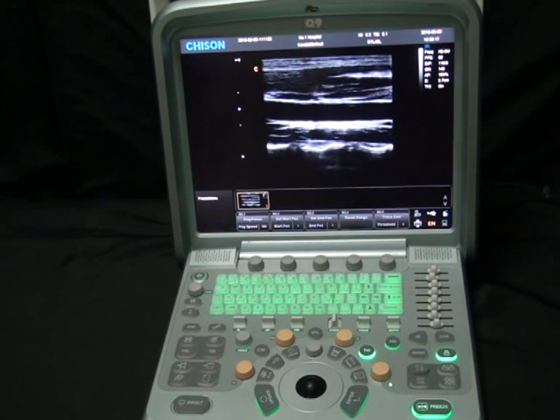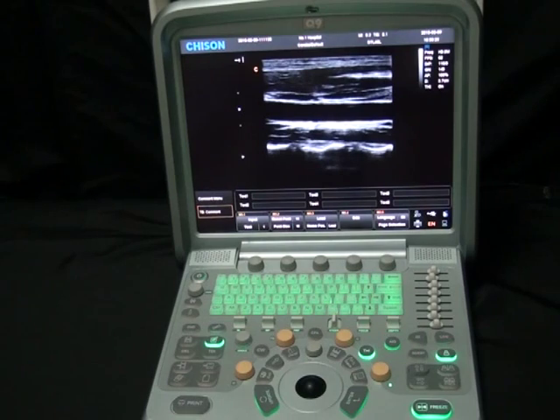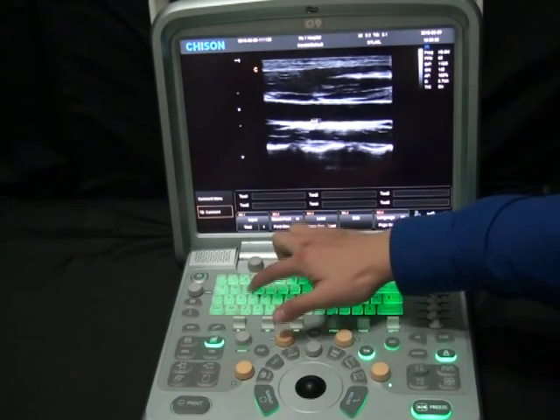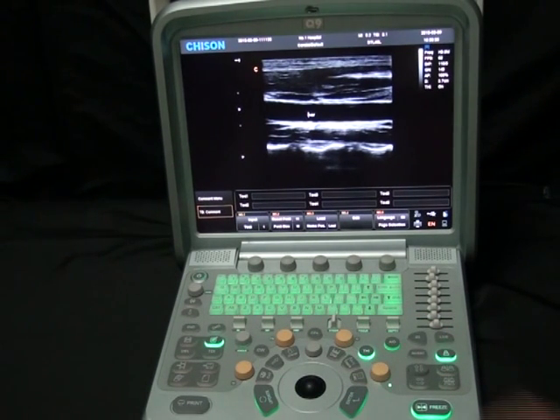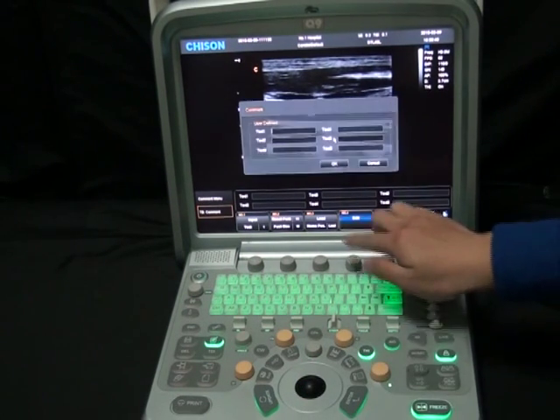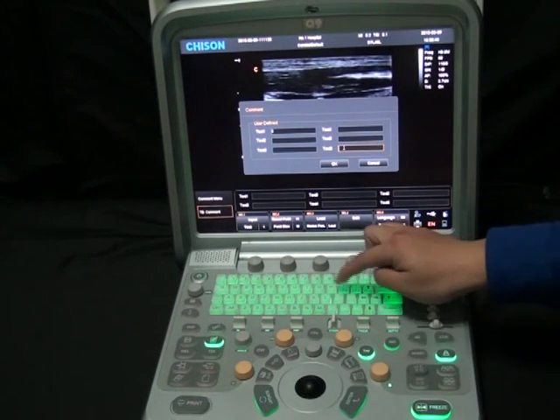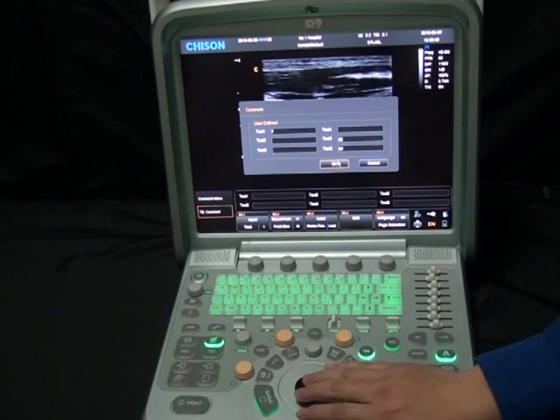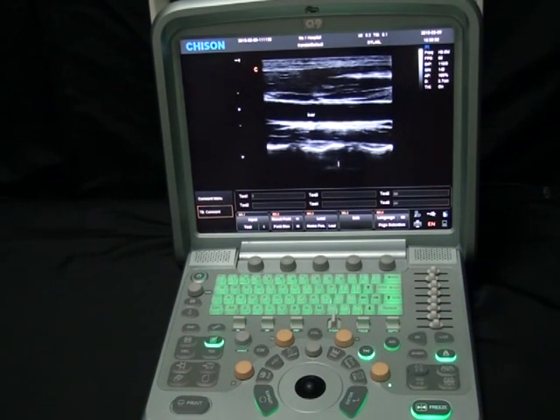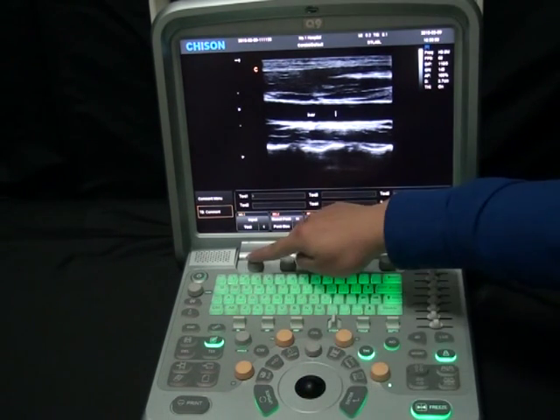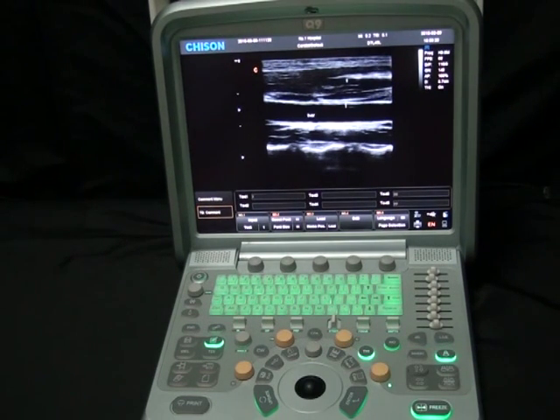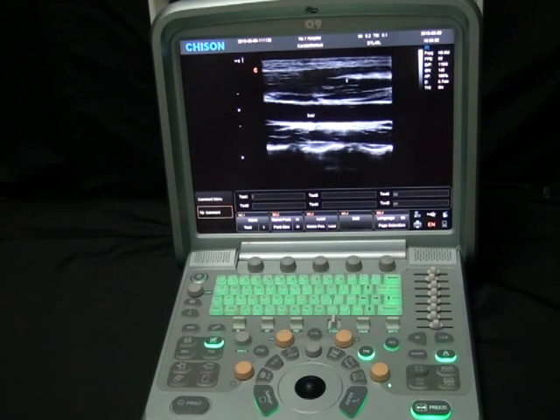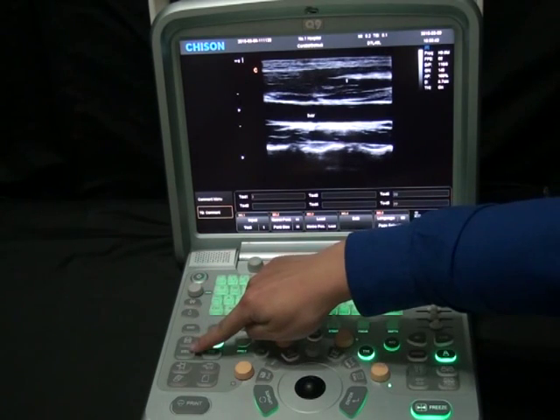If necessary, we need to do some annotations. Press the Annotation button to enter annotation mode — simply start typing text. You can backspace to delete, and move the trackball to position it, then click Enter. We can also add custom quick comments. Click Edit to add up to 6 custom comments for quick use. Enter the text, click OK. Select the desired text and push down to input it — it automatically appears on screen. Click Enter, move it elsewhere on screen, and click Enter again. We can change the font size, reset to original, or change the home position. Use the delay key to clear all comments at once.